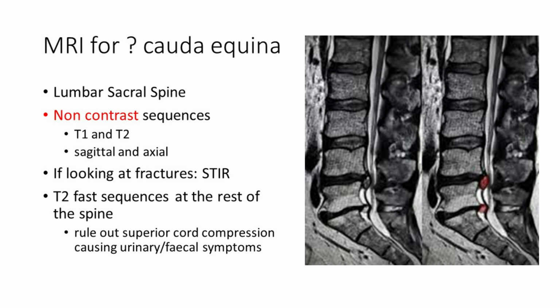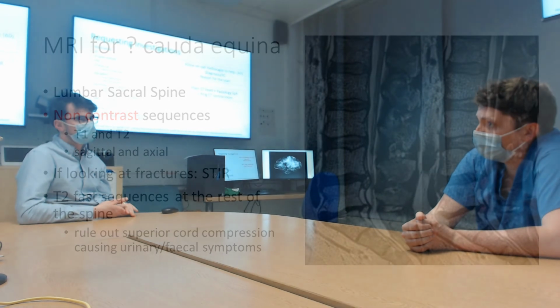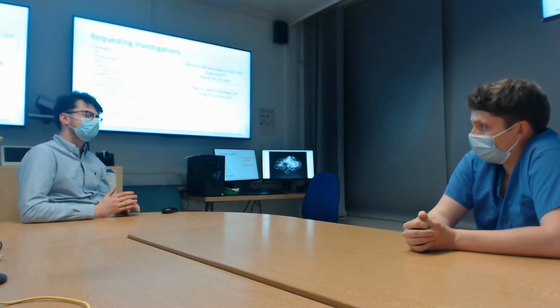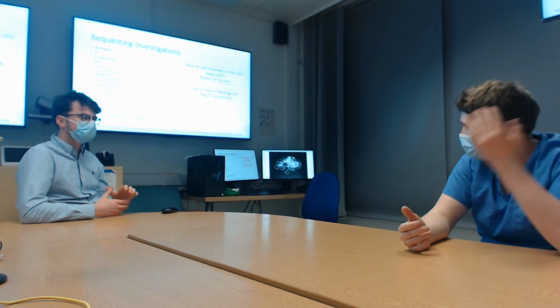These days, although if the patient's heavily sedated and you can't find out, and you don't know if they even have any implants at all, the other way of doing that is doing x-rays to find out, and occasionally we have to resort to that. Yeah, so a series of x-rays. I think it includes the skull, and often the chest, and then depends how far you're doing your spine and on the MR scanner, so that's a little bit unique to each unit.